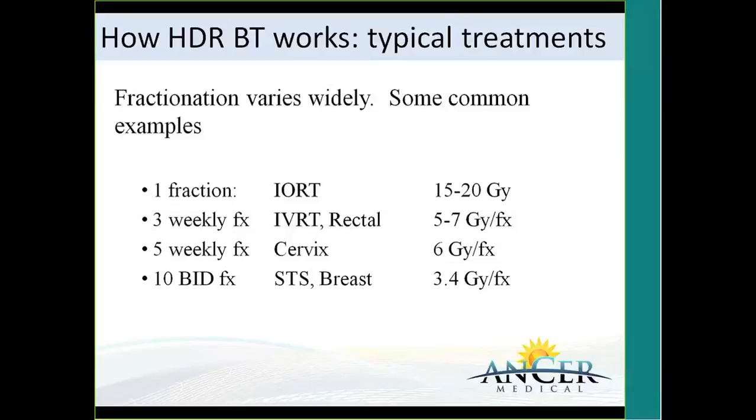That is true with a caveat, because there are treatments that you can read about, SBRT, for example, and SRS, which is stereotactic radiosurgery, or stereotactic body radiation therapy, where you can actually collimate the beams very tightly around the tumor, and with image guidance, you can get very conformal treatment plans.